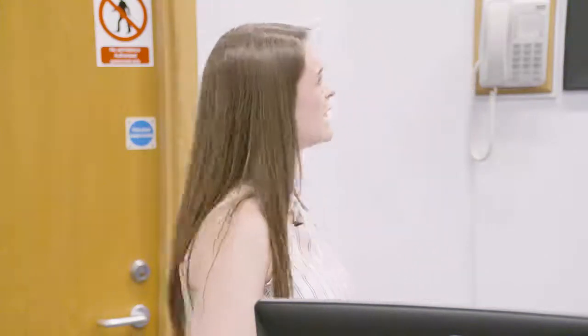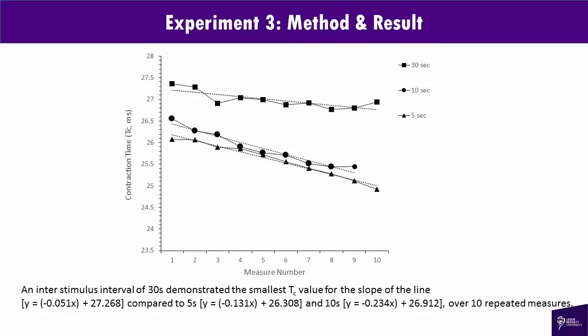And then when we also look at how stable the measures are over time, this is the measure number 1 to 10, and we're looking at contraction time here. You can see that the most stable interstimulus time over time is 30 seconds.